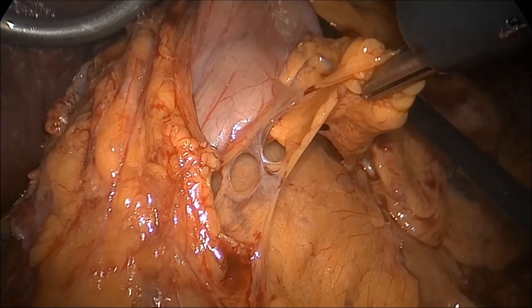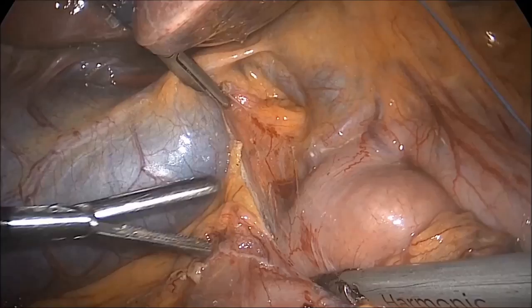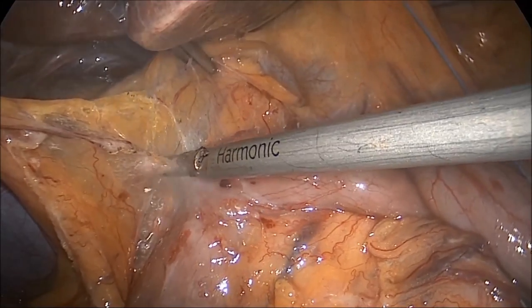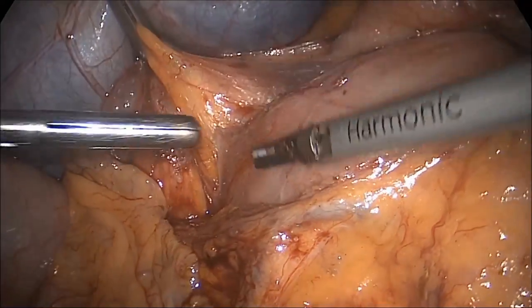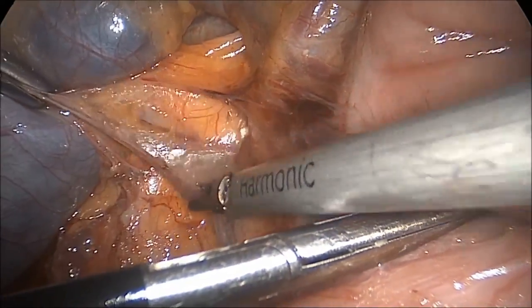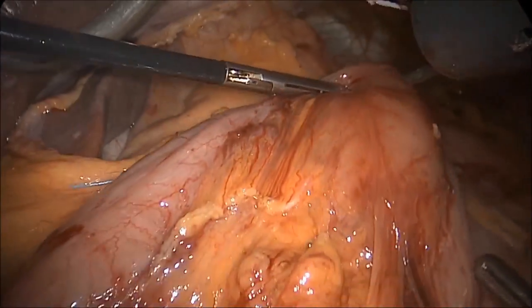Further mobilization of the posterior wall of the stomach is completed in order to lift the stomach anteriorly. A wide Kocher maneuver is then performed, and the attachments to the hepatoduodenal ligament are incised. This helps to ensure that the conduit can span the length of the thoracic space without tension on the neck anastomosis. The pylorus is then brought to the hiatus, which indicates that sufficient Kocherization has been performed.